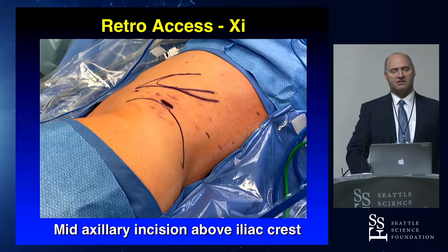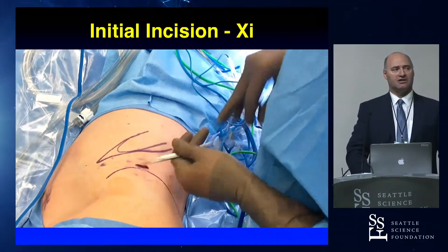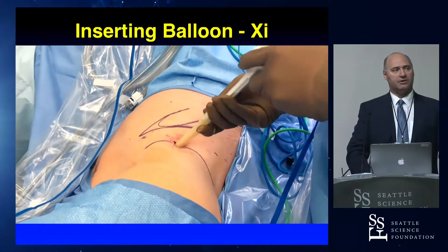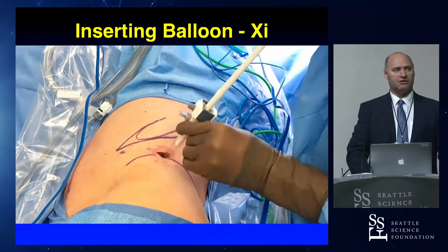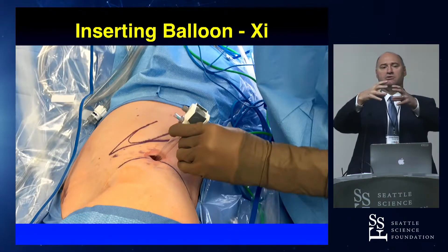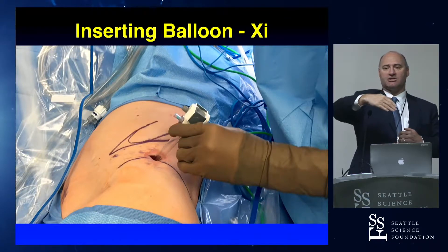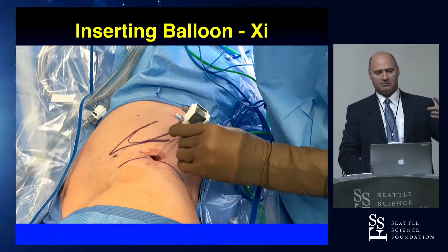To gain access for the XI, we make an incision in the mid-axillary line, then pop through the lumbodorsal fascia with a tonsil clamp. Once in the retroperitoneum, it's very soft — you feel the lower pole of the kidney and the iliac crest. We then put a balloon dilator in, using a little obturator to bring it in further. Notice the orientation of the balloon — there are two valves on one side, and the balloon expands perpendicular to those valves. You want that balloon expanding parallel to the psoas muscle. We purposely have those two valves facing the assistant so it expands in the correct direction. That is a minor detail, but it makes a big difference.